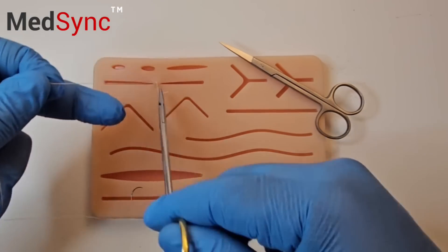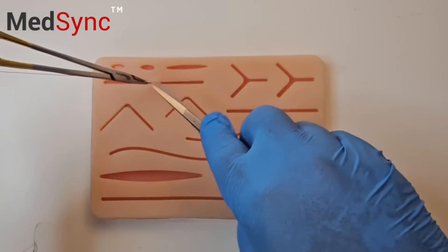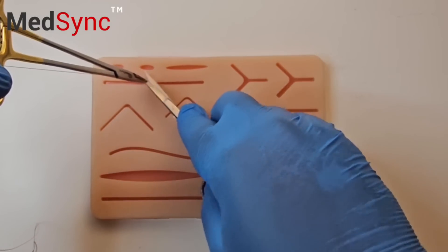You pull all the instruments into one hand — my left hand. You open your scissor, slide down, and you cut.